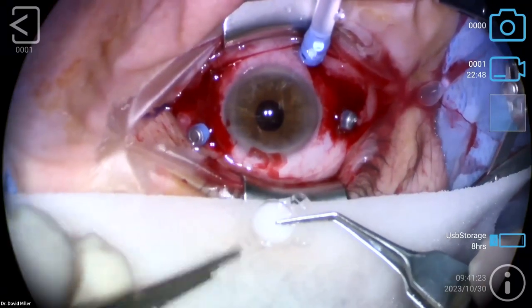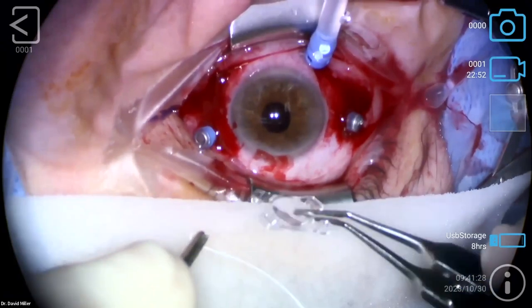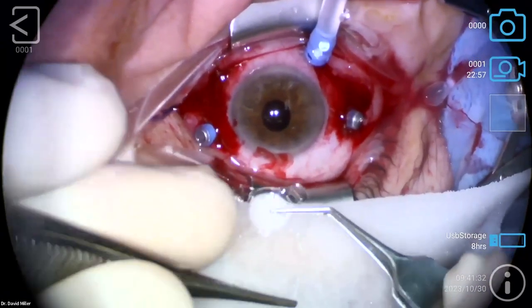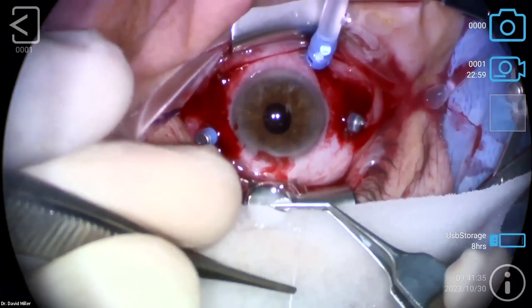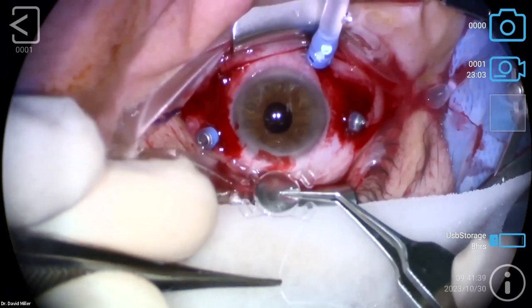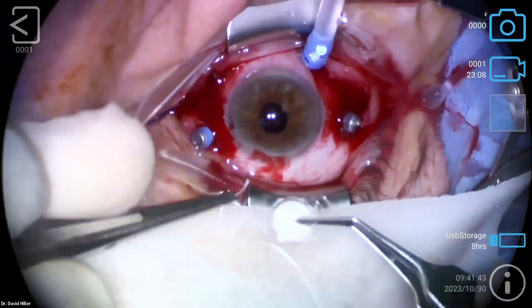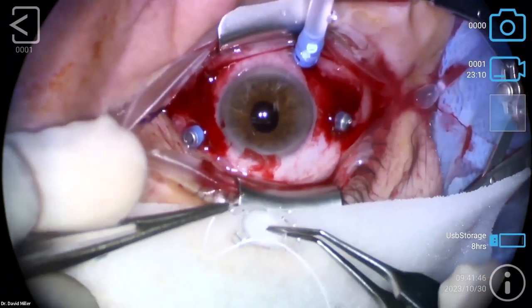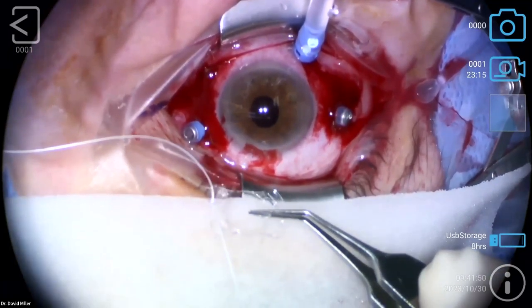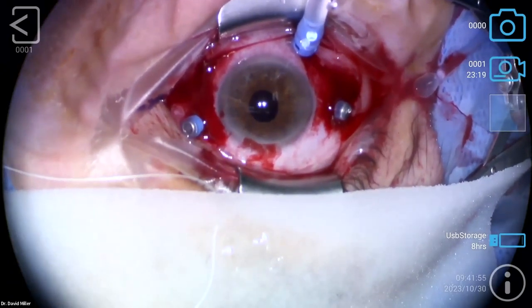The way it goes in the eye, these lenses have a convexity to them, right? So we want it going backwards, so it's kind of convexing this way. And the other thing to know is that two of the haptics are notched, and the one that's notched right here is the upper right. I like to put my sutures in from the top and come back up. The point being, I think it makes a little better chance of not rubbing up against the back of the iris. And that's one side.